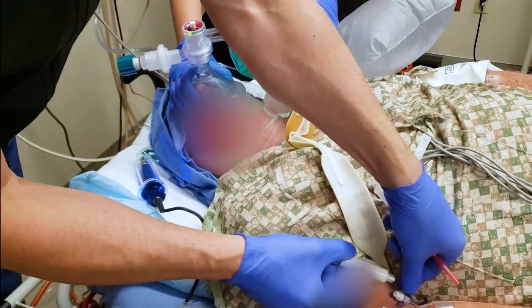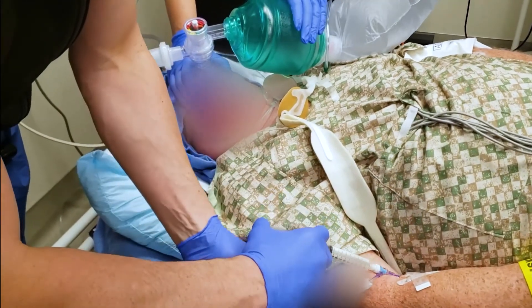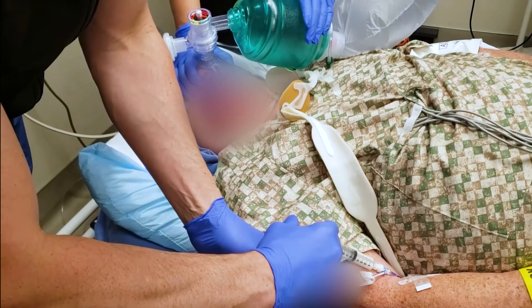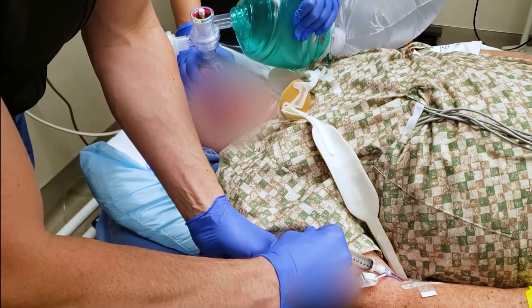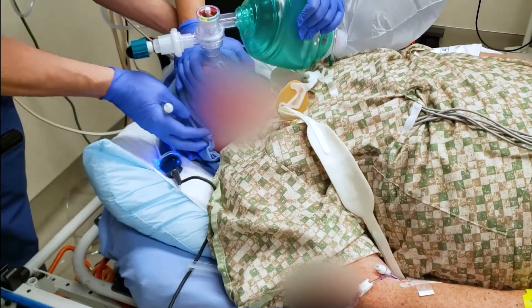A normal intubation dose of propofol is about 200 milligrams — that's 2 milligrams per kilogram. Our particular patient here is about 100 kilograms, which is why I mentioned that dose.